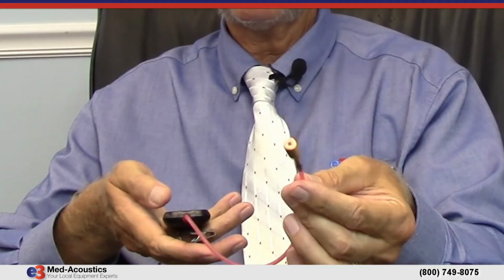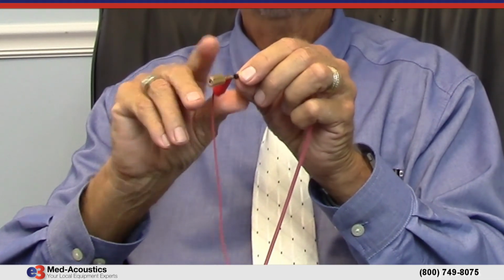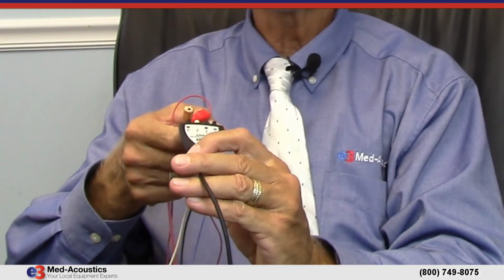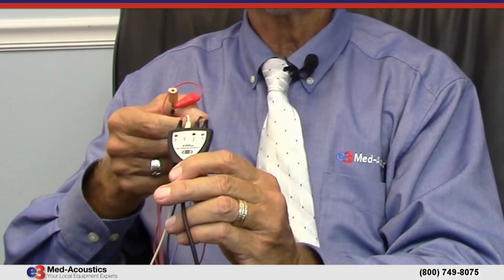I also naturally have that connected to the insert phone, and I'm going to connect to it now once it's in the ear canal, deeply inserted, this little alligator clip. It's a rounded alligator clip that's just perfect. I'm just going to connect that on the end of the stem, making sure that I actually have that wrapped around the gold foil. And I'm going to plug that in, right into the red connector, left into the blue connector, and of course the white one will be on CZ, the high forehead, and the black one's the ground. That would be low forehead. If there's no room on the low forehead, then of course you can offset it on the side of the forehead if you had to.